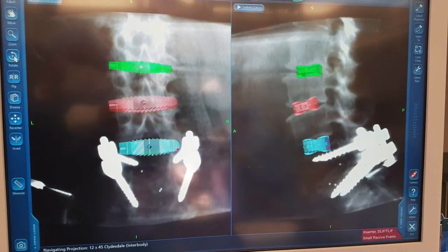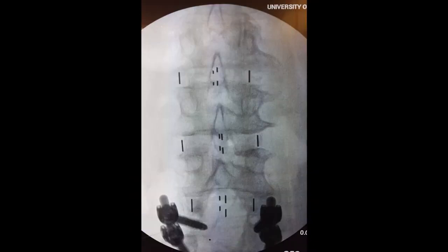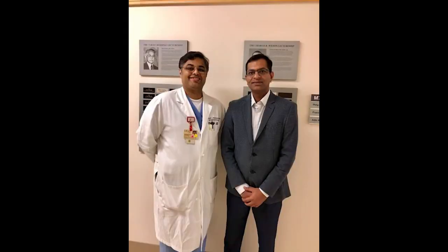Do X-ray confirmation of cage placement in AP and lateral views, and repeat the same procedure for the other two levels. We did three levels — these are the lateral X-rays confirming position, and this is the AP view. Once done, you can place screws in the lateral position using your navigation probes, or alternatively reposition the patient prone and insert pedicle screws.